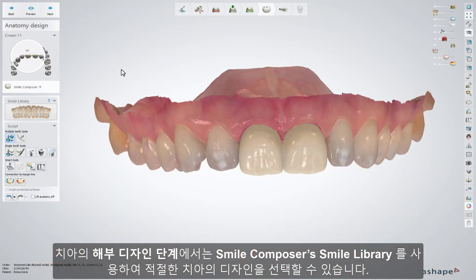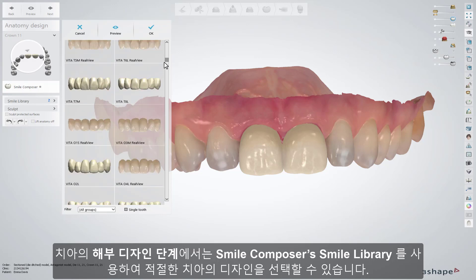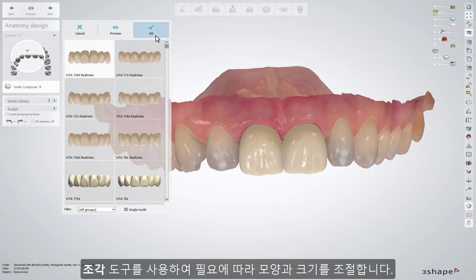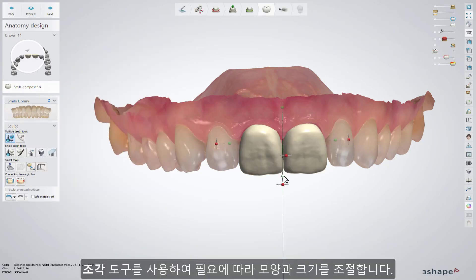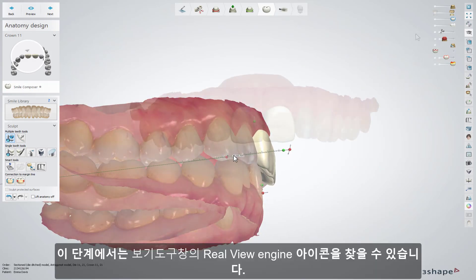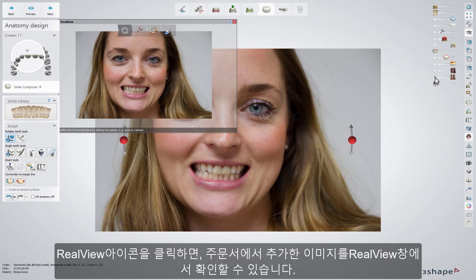When you reach the anatomy design step, use the Smile Composer's Smile Library to choose the correct shape of teeth. Use the available sculpt tools to adjust the shape and size according to any requirements. Here in the anatomy design step, in the Viewing Tools bar, you can find the RealView Engine icon.